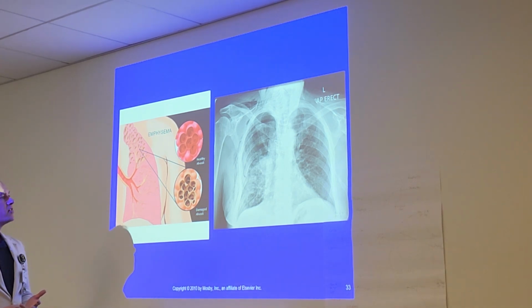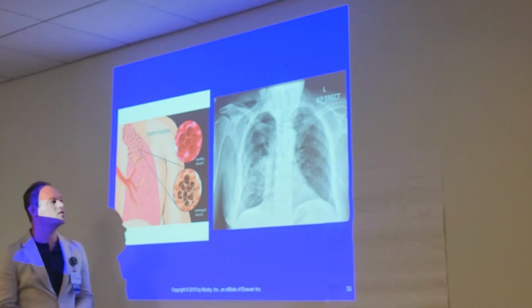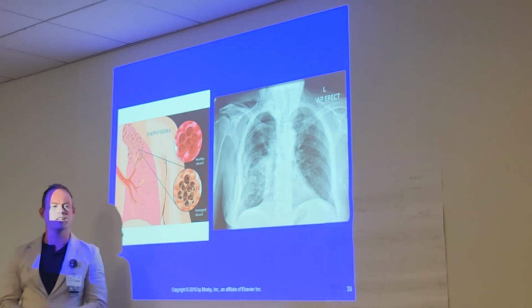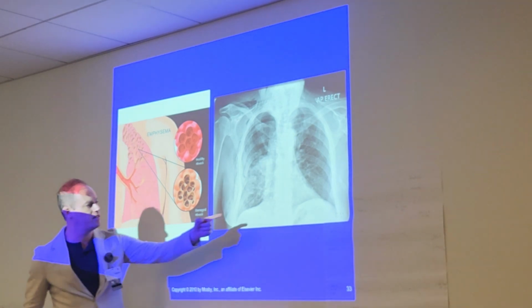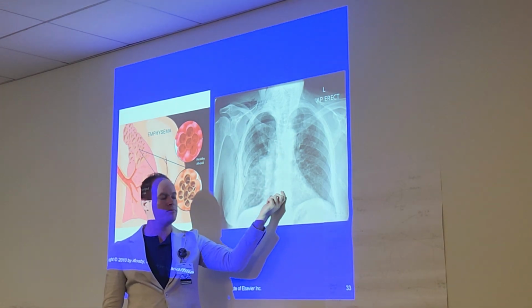Looks like I got some rib fractures. Here, they've had heart surgery. They probably did CPR. Not necessarily. What are those? You don't need clips like that for CPR. Oh, I see what you're saying. What are those like oval things on the spine? These are surgical clips. That means that they cut the chest open at the sternum for heart surgery. And that's how they put it back together.